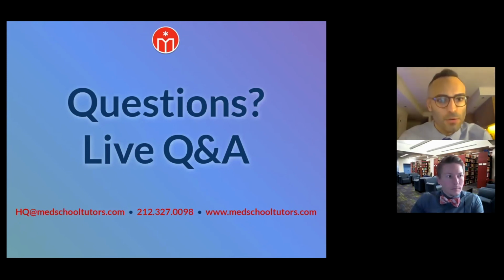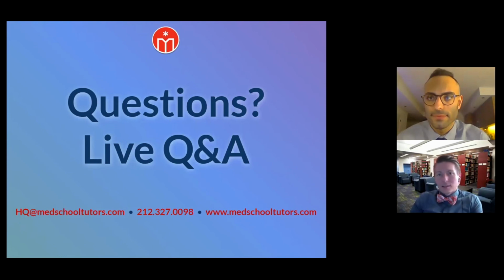Okay, now we have some questions coming in. Let's see. Hold on one sec. I'll go ahead and jump in while we're reading a couple questions that popped in here. In particular, one of the things that I recommend to the students I work with, and a lot of other tutors recommend to their students as well, is that you should try to identify the pathology, try to figure out the diagnosis based on the vignette, and then use the image that's supplied in step 2 CK or shelf exams to amplify the answer that you're already looking for.